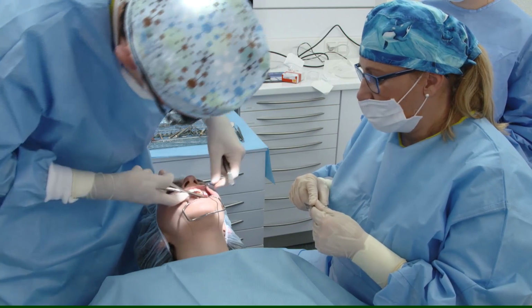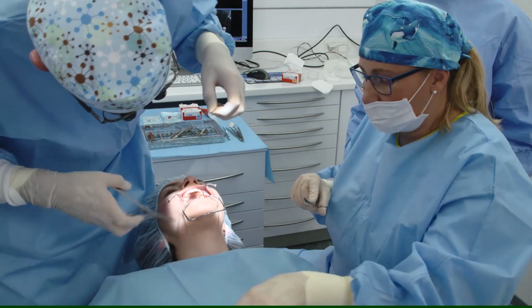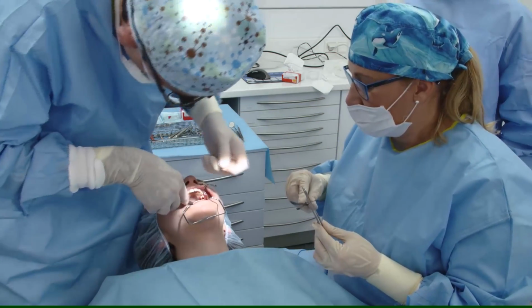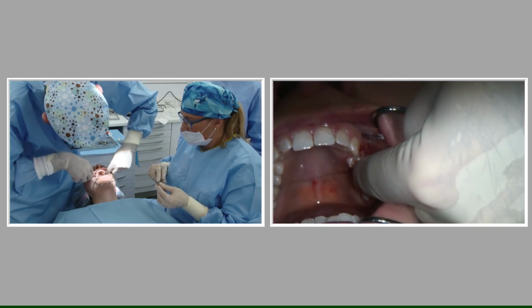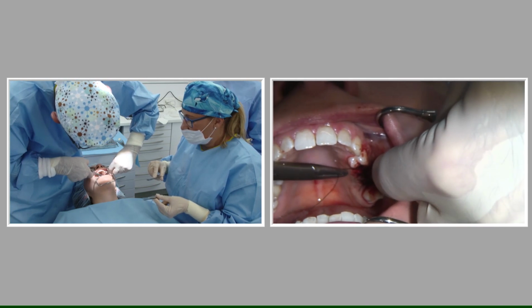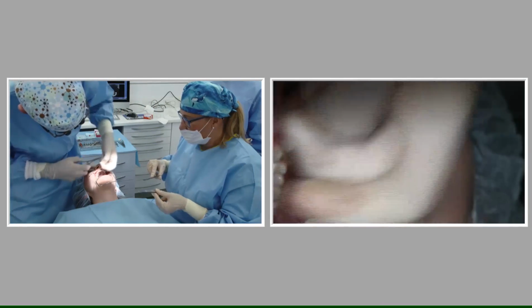With no sinus grafting, no bone augmentation, because we used the residual bone. We could see this by backward planning on the base of a CBCT matched with the Omnicam scan.